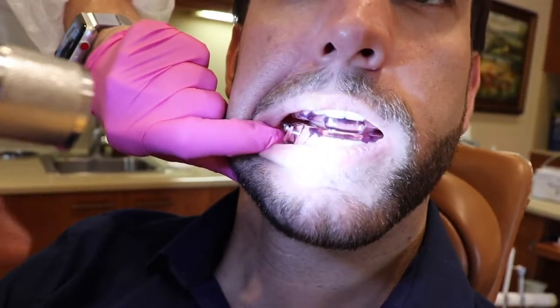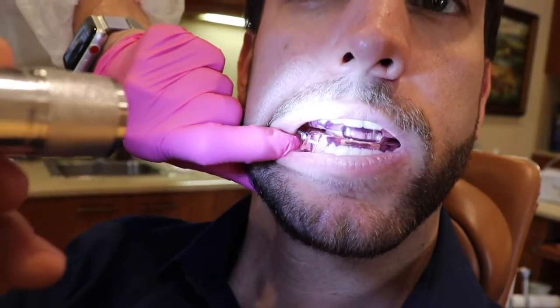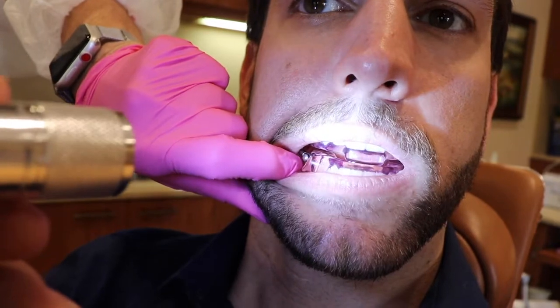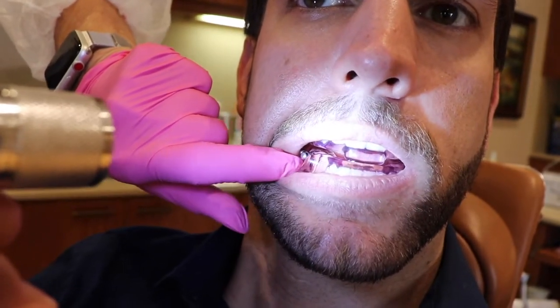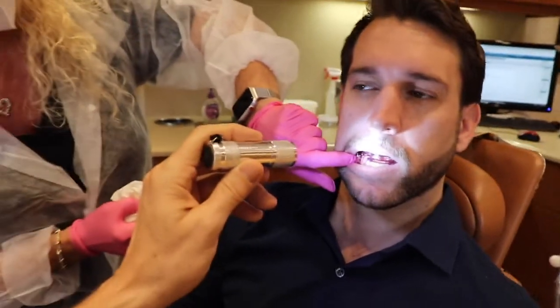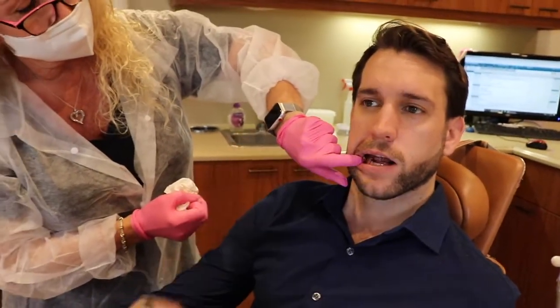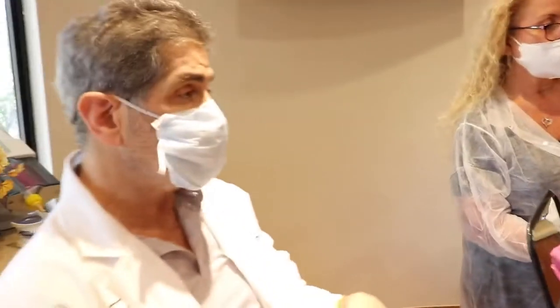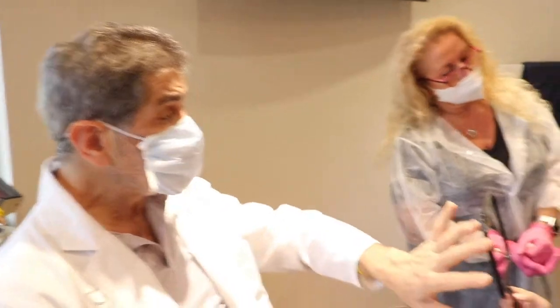Point out the cheek protectors. Somnomet has milled into this appliance a cheek protector — I call it a tissue bump. What it does is, the biggest complaint we have from patients is usually the Herbst screw. By making that cheek protector, it pushes the tissue away so the tissue doesn't have direct access to the screw. You're not going to perceive the screw is there. That tissue protector is nice and smooth and rounded — you may become aware of it, but it's not going to feel uncomfortable like the screw is.